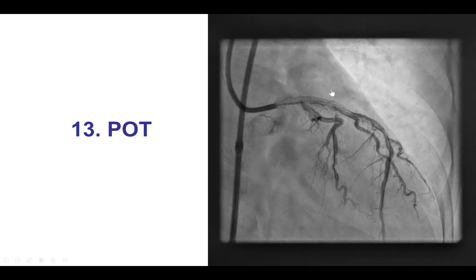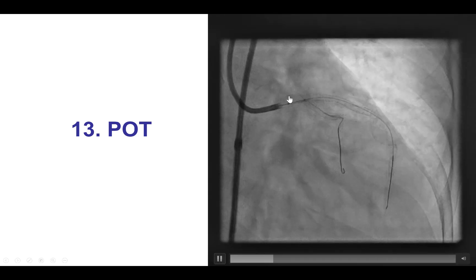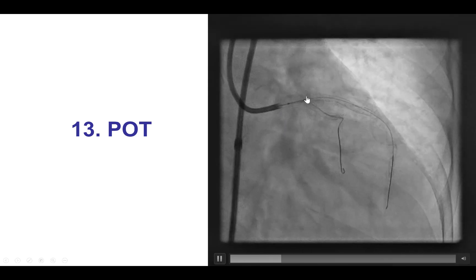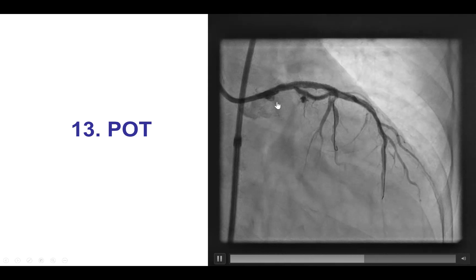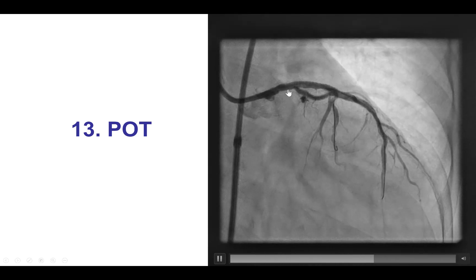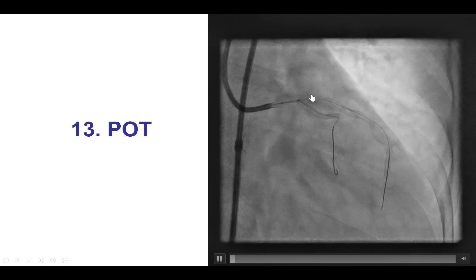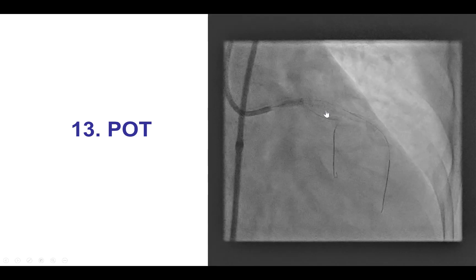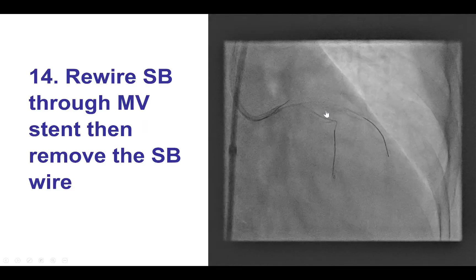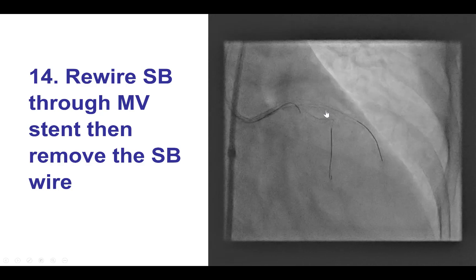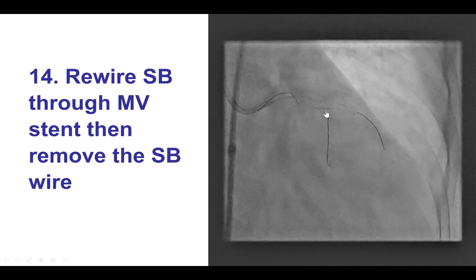The next step is to perform the proximal optimization technique (POT). This is critical to facilitate rewiring into the side branch — otherwise the wire might go under the stent struts of the main vessel stent and deform the stent when balloons are inflated. The balloon was inflated — that was a 4.0 mm balloon — and then the side branch was rewired.